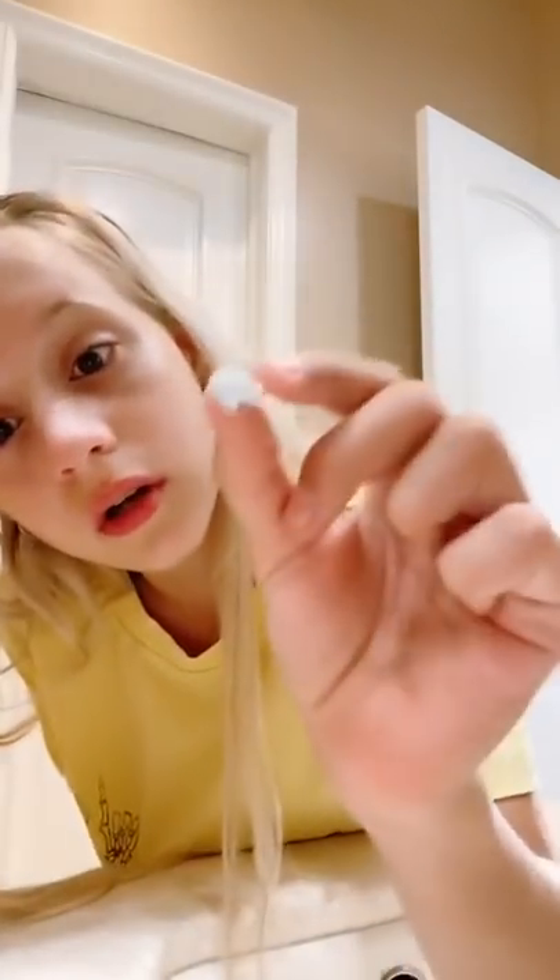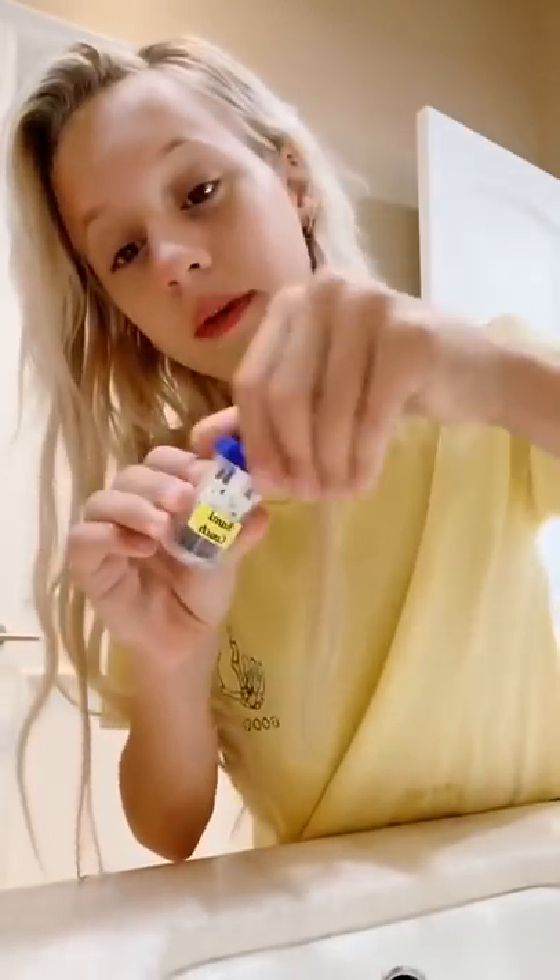I'll show you what they're all about. These contacts are really hard and they can break easily, so you have to be careful. You put them in like normal contacts, but you take them out with a plunger, so that's a bit weird.